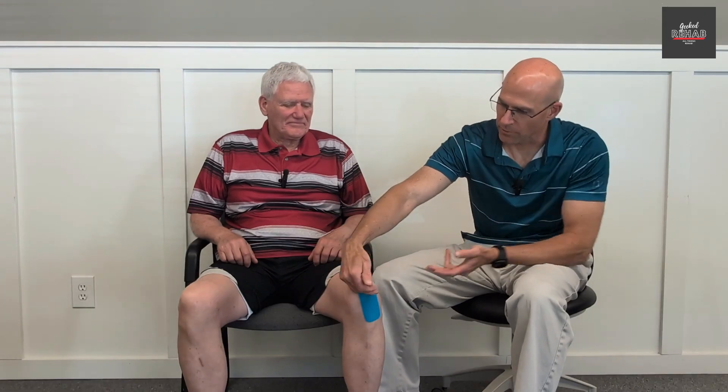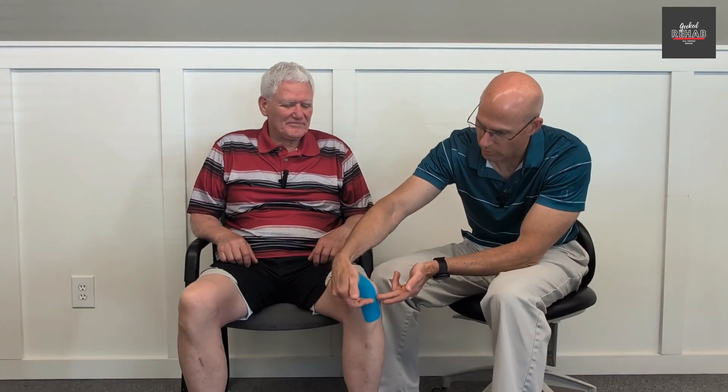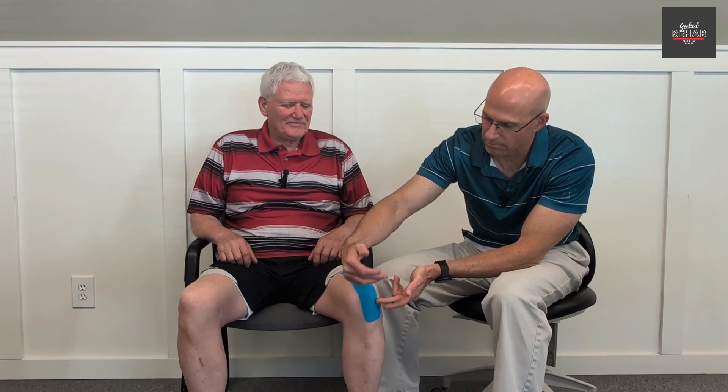I'm going to show you another tape job. It is to help decompress the inferior — or distal, or lower — part of the kneecap, and this helps another way to reduce patellar tendonitis. Basically it's for the inferior pole, or the lower part of the kneecap, to help give it a lift.